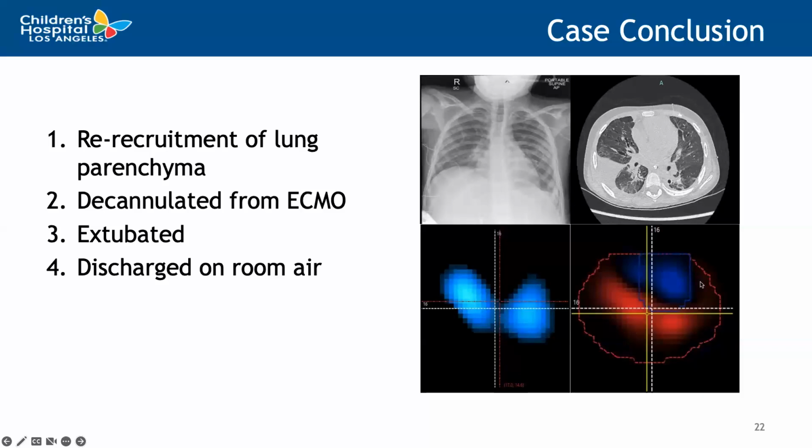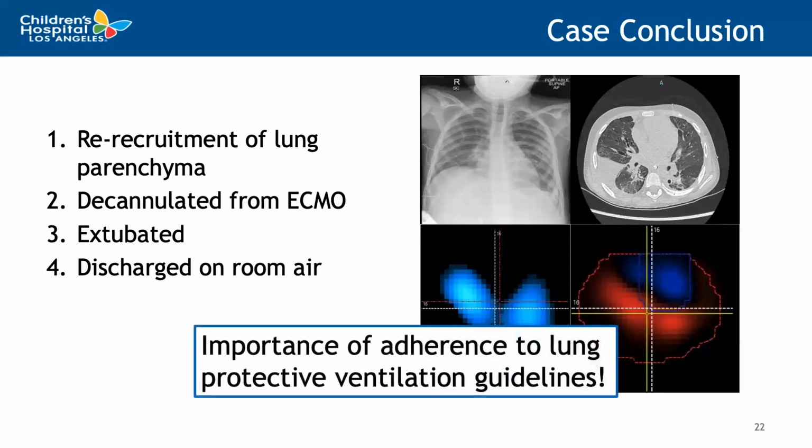Not only does this case highlight the importance and role of EIT for monitoring at the bedside both ventilation and perfusion inhomogeneity and guiding clinical practice, but it really drives home this point of adherence to lung protective ventilation strategies and guidelines.